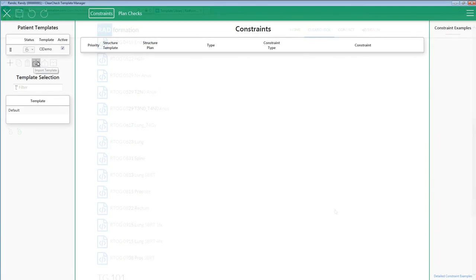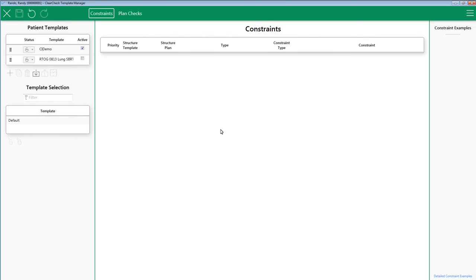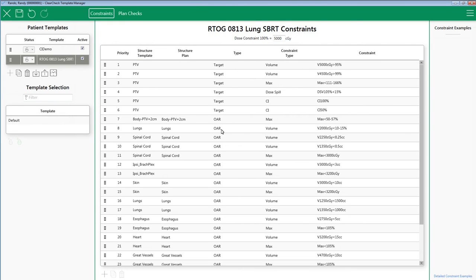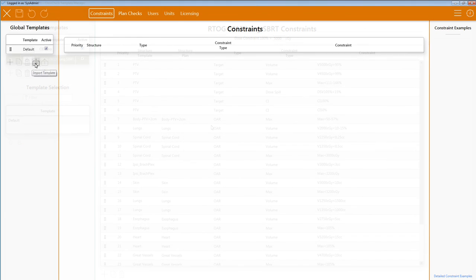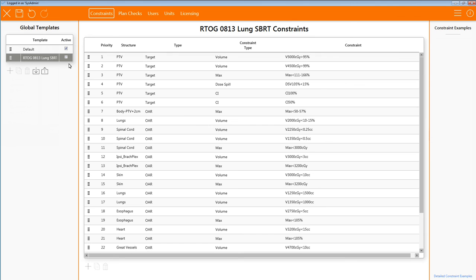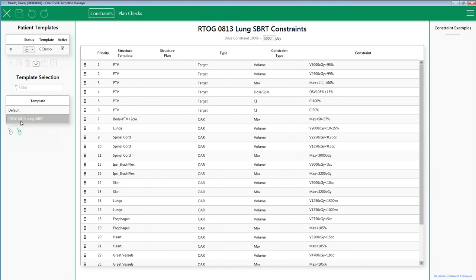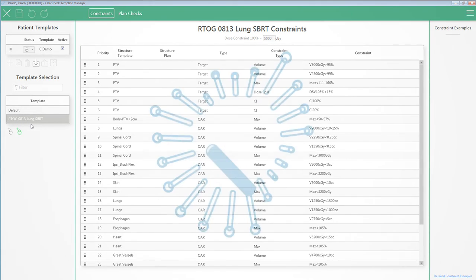In the patient template manager, hit the import icon. Verify you agree with the constraints and you're ready to begin. Please note that this can also be imported into the administration application. Then, your template would show up in the template selection area for everyone in your department to use.